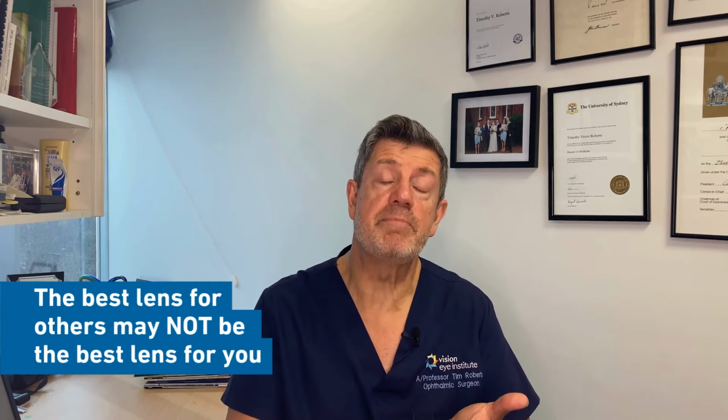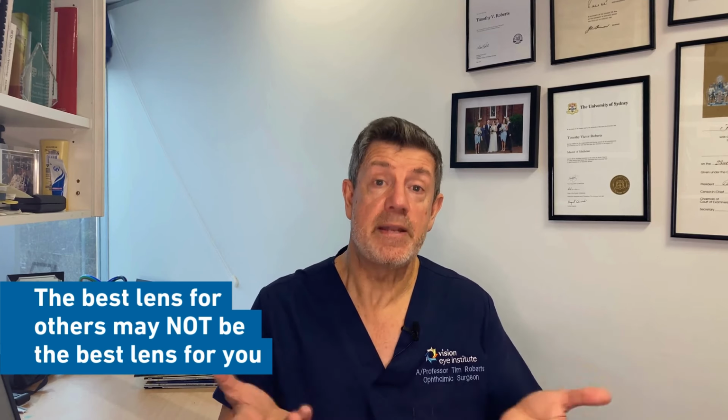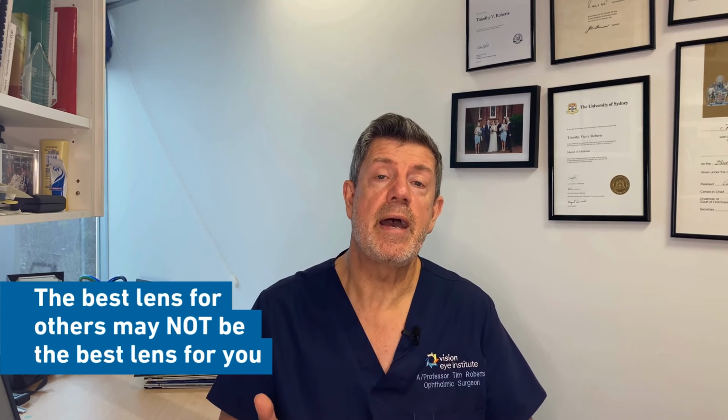And the third concept is what your husband, wife, neighbour or best friend had implanted in their eye doesn't mean that's the best lens for you. And you may find that either the anatomy of your eye or what you want in terms of lifestyle outcome with vision will be different to what your friend had. So three things: there's no one best lens, compromise or a trade-off is not a side effect or a dirty word, it's a reality of the technology, and one size doesn't fit all.